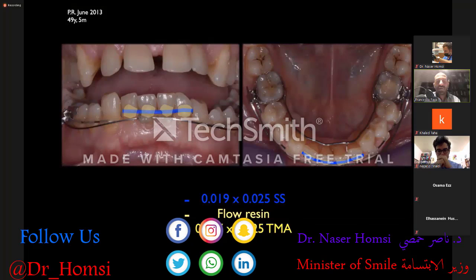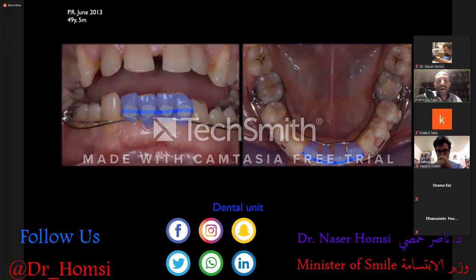Then we have a 17x25 TMA intrusion arch, which is connecting the anterior dental unit, given by the block of the four incisors, to the posterior teeth. The solid, stiff 19x25 stainless steel wire makes the four centers of resistance of the incisors become just one center of resistance of a group.